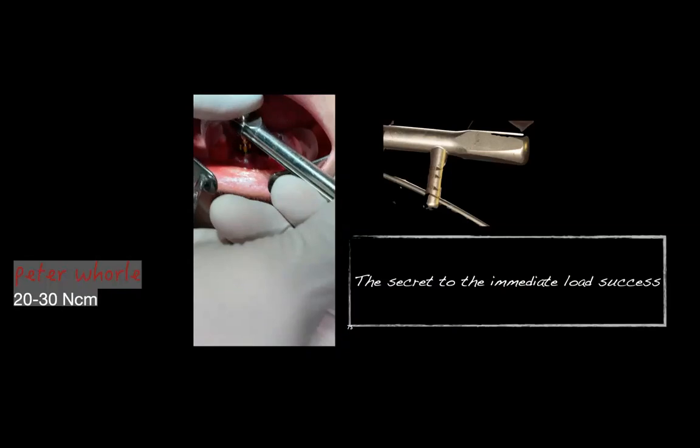If I was worried about the soft tissue shrinkage, and if this was a case where I didn't have to make an incision, I could have just taken an impression of the patient and had the final restoration ready in 2 weeks. That's how confident I am on this particular case. I restored this case on an 84-year-old in 6 weeks. I just waited for the soft tissue to heal.